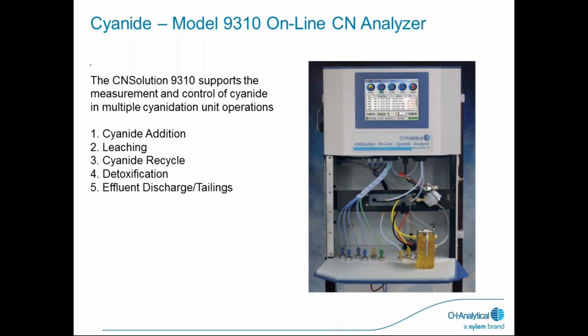A little breakout of the instrument itself. It utilizes the gas diffusion module, the amperometric flow cell, and reference electrode as well. It supports measurement and control of cyanide in multiple cyanidation unit operations. There's cyanide addition, leaching, cyanide recycle, detoxification, and effluent and discharge tailings.